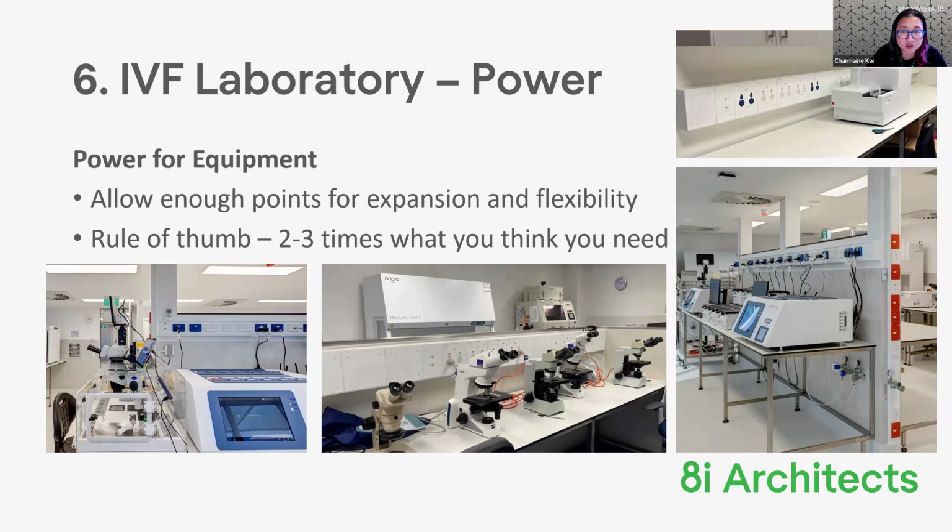It's not just power, but don't forget to put in data as well, because there's a lot of monitoring with the equipment that's required now. So you'll need data points as well. As you can see, I've got lots of spare points in this one in particular, ready to go for future equipment that's going in.